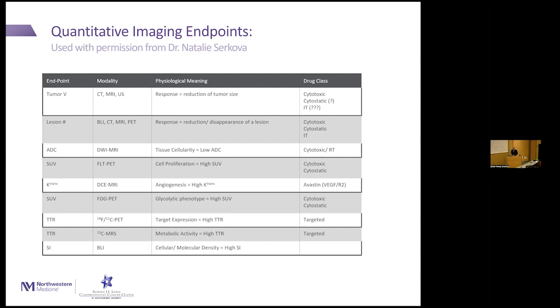Well, that's a good related question, which is, for a lot of what we do, our users focus on either the therapy or the mouse model. For example, we're starting a project with Tom Kume. He's interested in a genetic model for angiogenesis. If you knock out this gene, it's FOX something or rather, the angiogenesis changes. That's all he's doing. So what we do is we take his knockout model or mouse, and then we do DCE MRI, or we're planning to do DCE MRI. So all he does is focus on the mouse, and all we do is focus on the image.